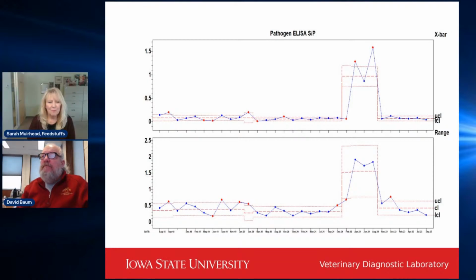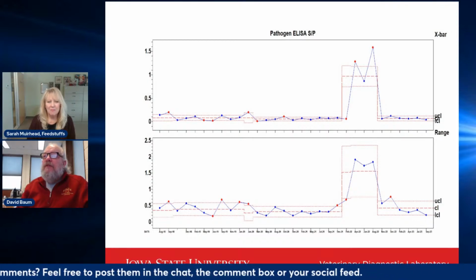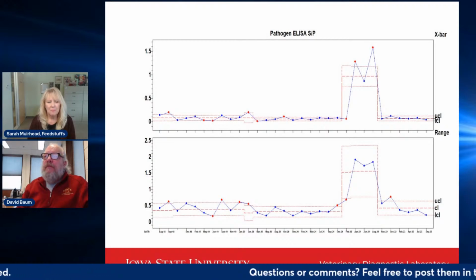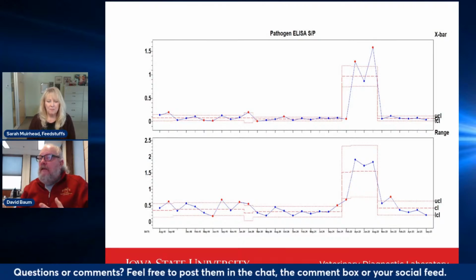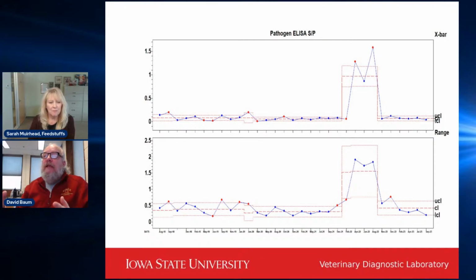Time continues to move on, and boom, we have another antibody kinetic curve. And the decision this time was to simply eliminate that population of animals from the site, and then bring in replacement animals from a negative population. To my understanding, and I will take any questions, this resulted in the population returning back to negative. And also, whatever was going on back here that produced the nonspecific reactions in this population is occurring in the new population of animals as well.